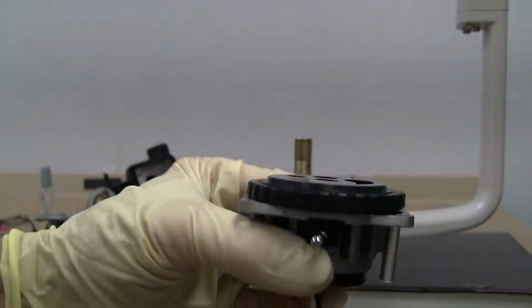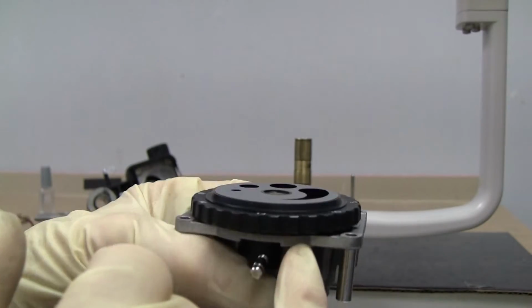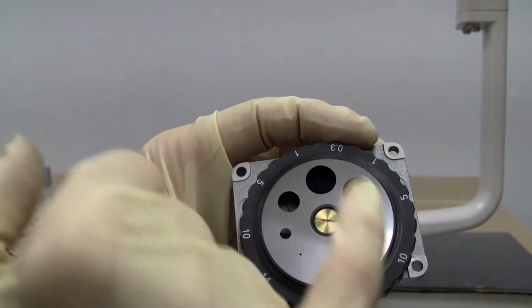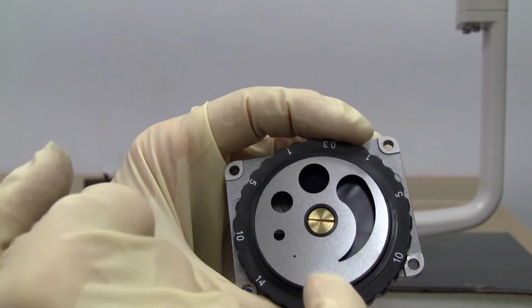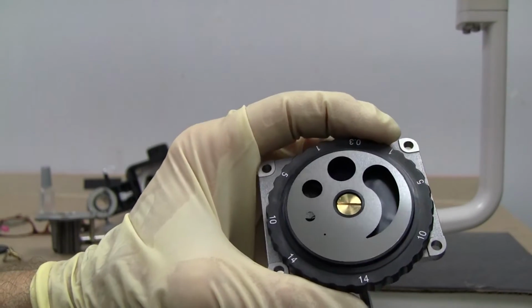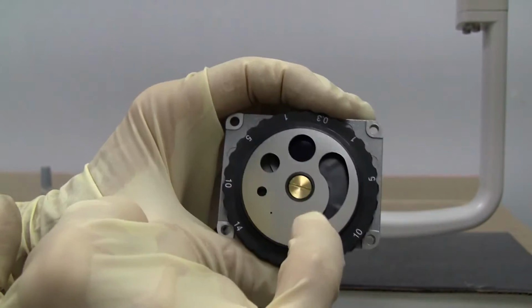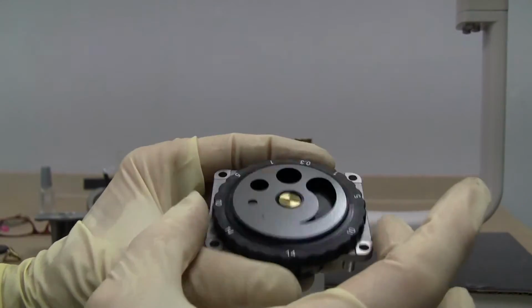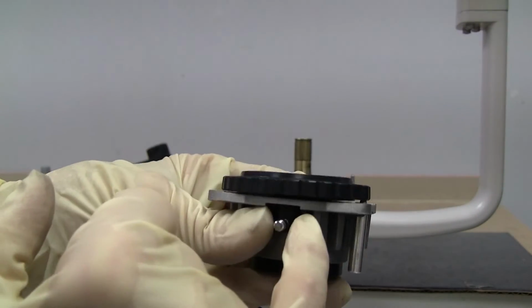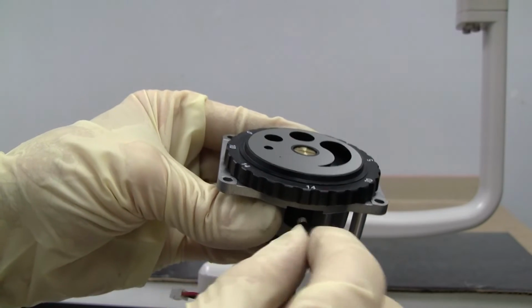Going to have to take this center screw out, but remember we've got a spring and a bearing here that we'll have to take note of, and be careful when you're working around your diaphragm that you don't touch it, otherwise you're gonna put debris on your diaphragm, and it's hard to clean after you've put it all back together. So we're going to remove this screw, take off our diaphragm wheel so that we can look at our filter wheel underneath it and this gear and see what's going on underneath.